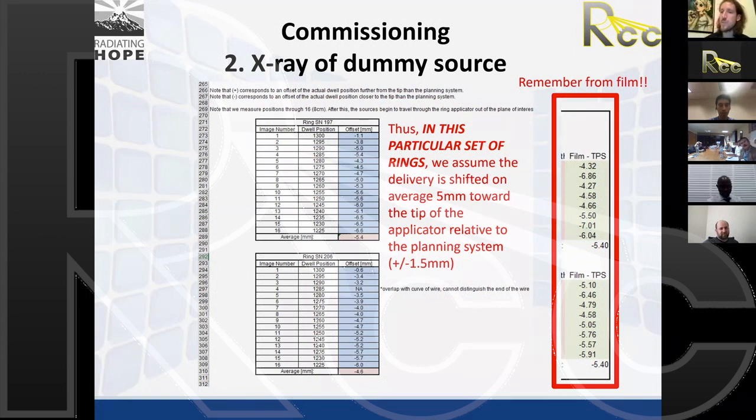As explained, this is one possibility to use in step forward systems, and as was explained in Ben's presentation yesterday, you will get this fluctuation about the average.